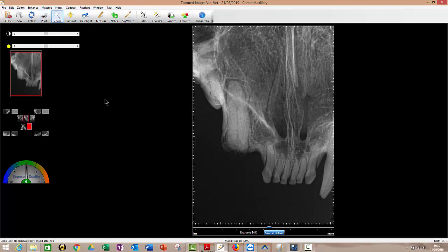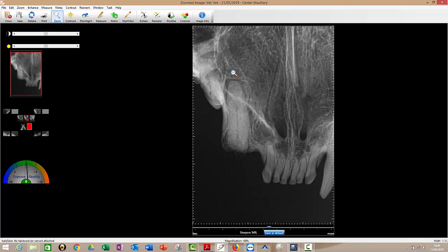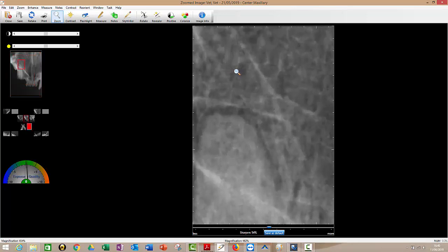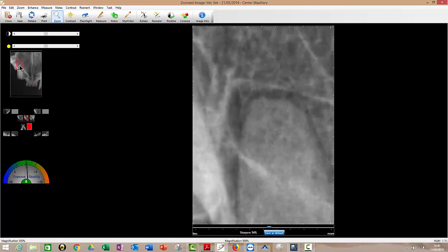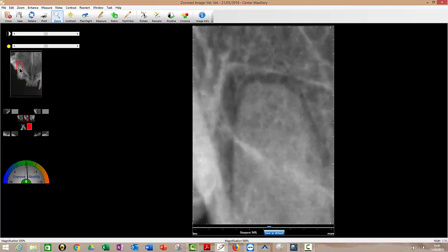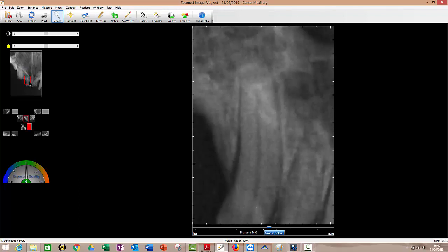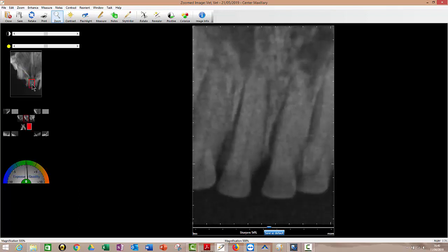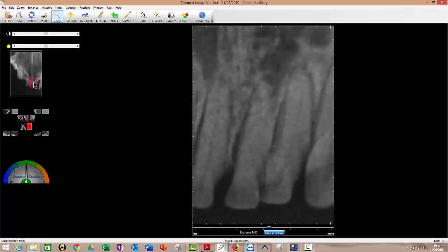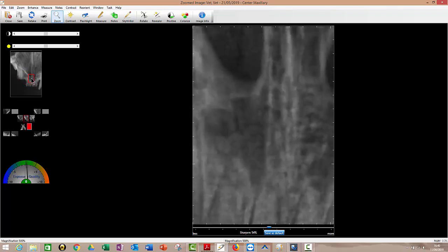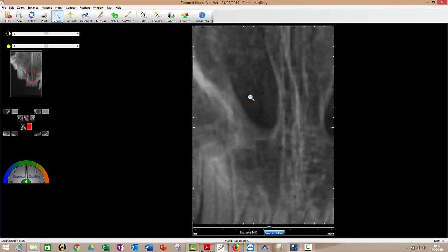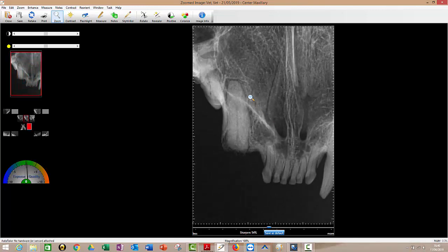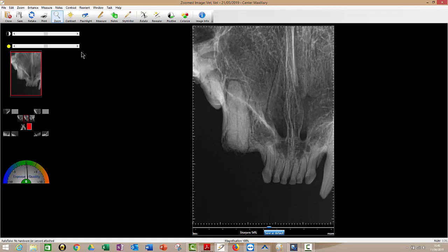You have some other image enhancement options up here. So by default, you're already on zoom. You see my cursor is just a normal cursor here. But when I move it onto the image here, it becomes a magnifying glass. So if I double click my left mouse button, it will zoom in. And you see this little red box here. I can now drag that around if I want to zoom around and have a good look at everything I can do. And when I'm ready to zoom out again, I just reposition my cursor over here and double click again.